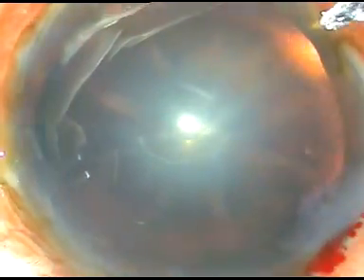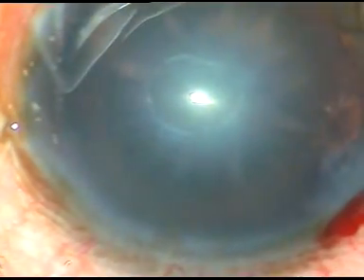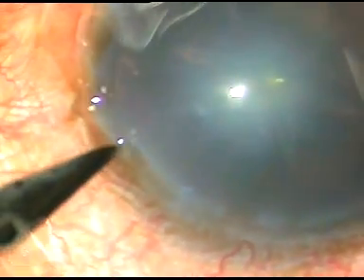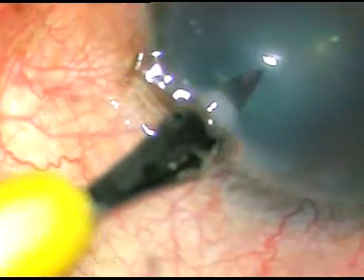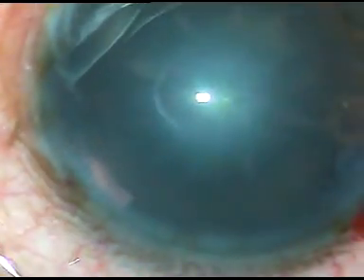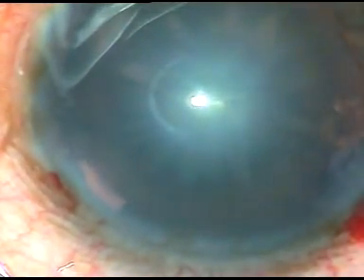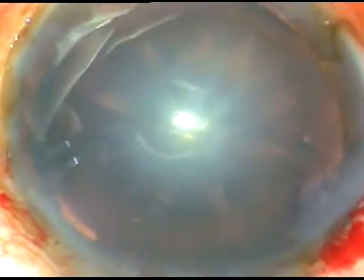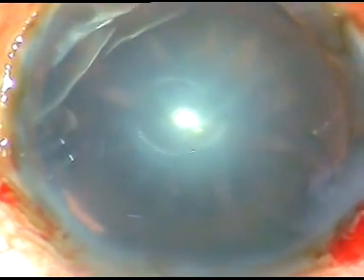Now I make 2 stab incisions. This is one on the right side of the main incision and this is another one on the left side of the main incision. The stab incisions in this case are about 3 clock hours away from the main incision.